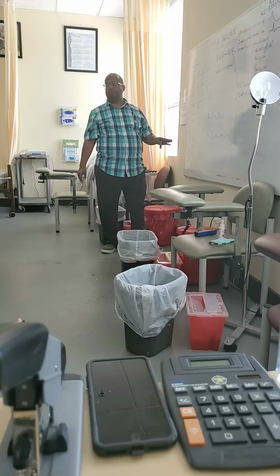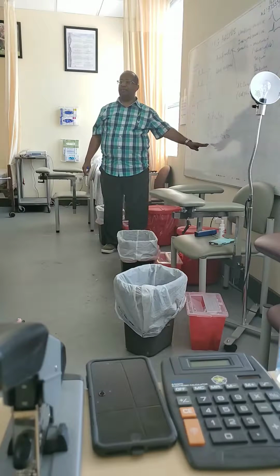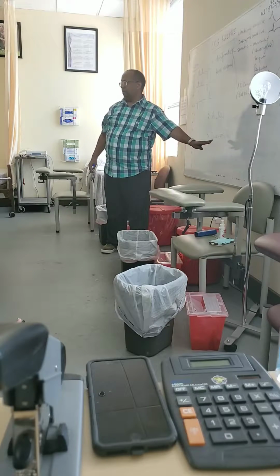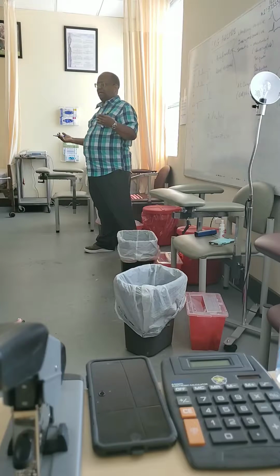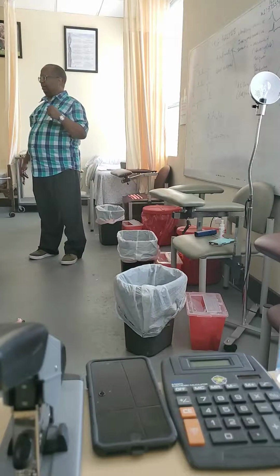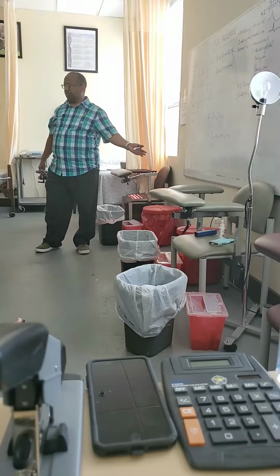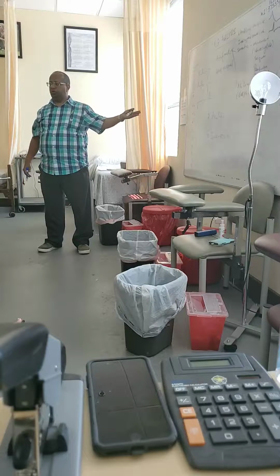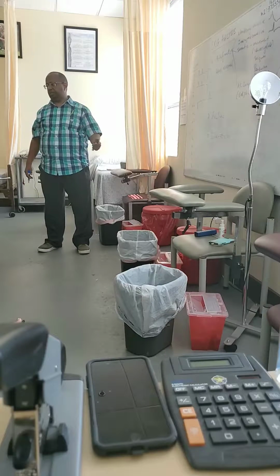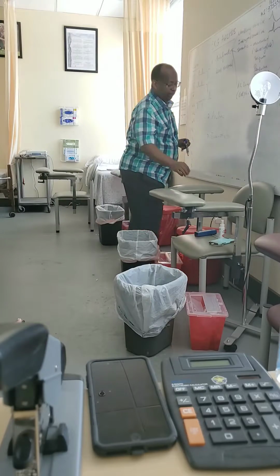It's good to know some basic kinds of interpretation. If not today, maybe we can discuss interpretation next time, so that you know some basic kinds of interpretation, especially if you are working in EKG units, cardiac units, or telemetry units. You need to know all these interpretations. Okay, now let's go to analysis.